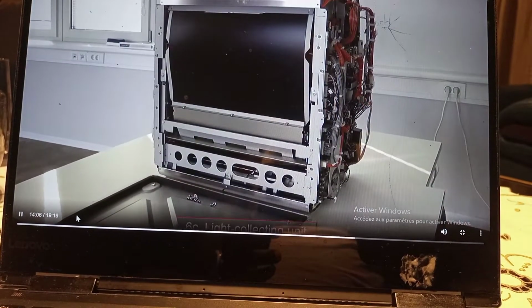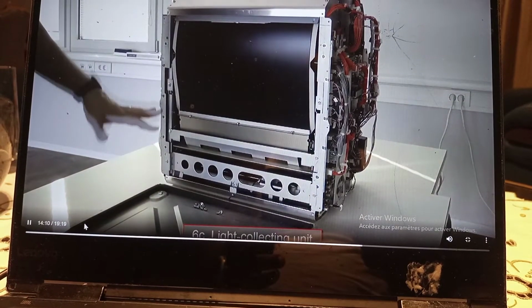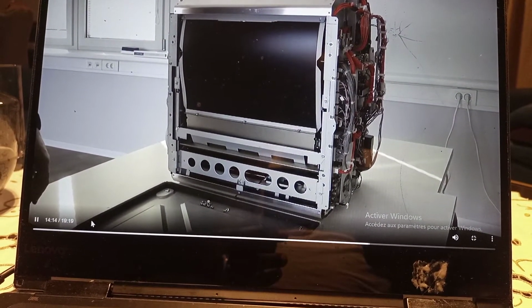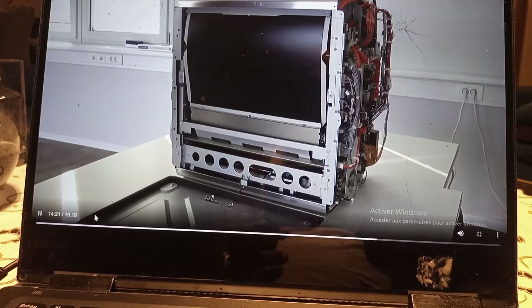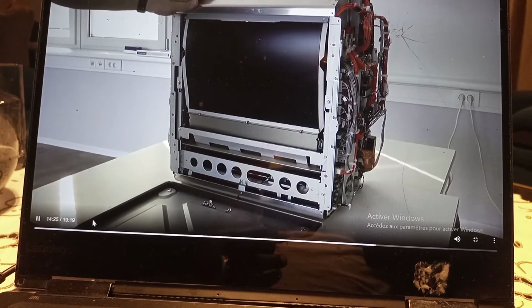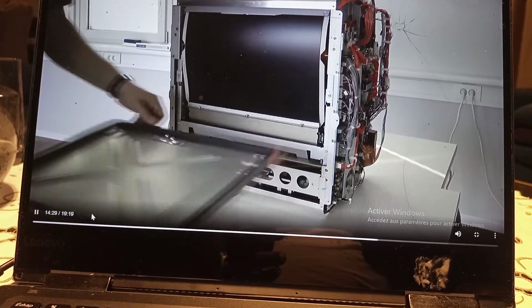Okay, to change the scanning optics unit, which is accessible from the bottom side of the device, first you need to remove the back side, then turn the device on the back side to stand like this. Remove all the screws from the bottom plate so you can remove the bottom.